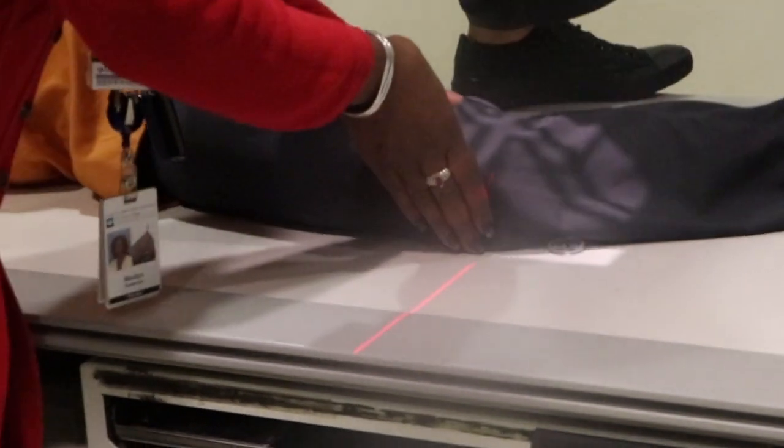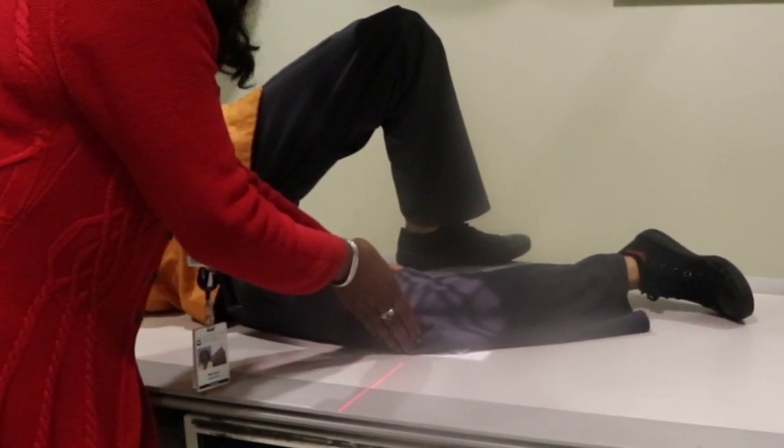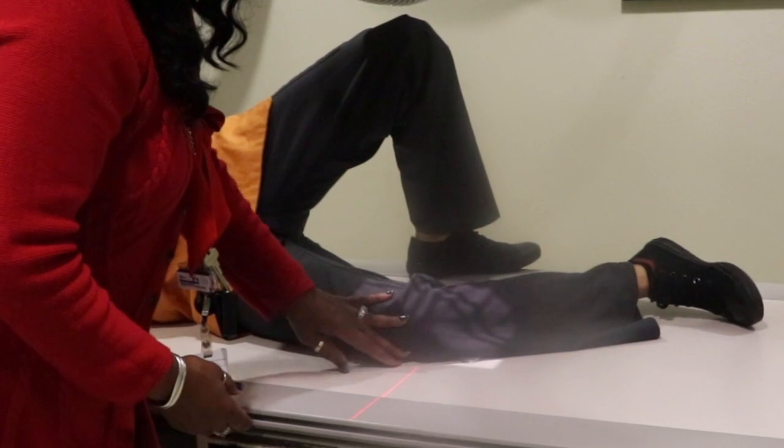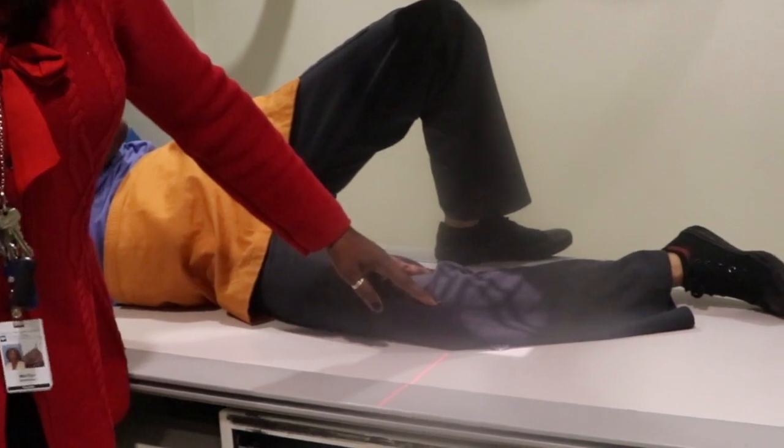Feel for the patella. Make sure she's still rotated down toward the table, which is where you want it. Notice that when you rotate her leg down toward the table and her patella is perpendicular, sometimes the patient's heel will come up off the table.